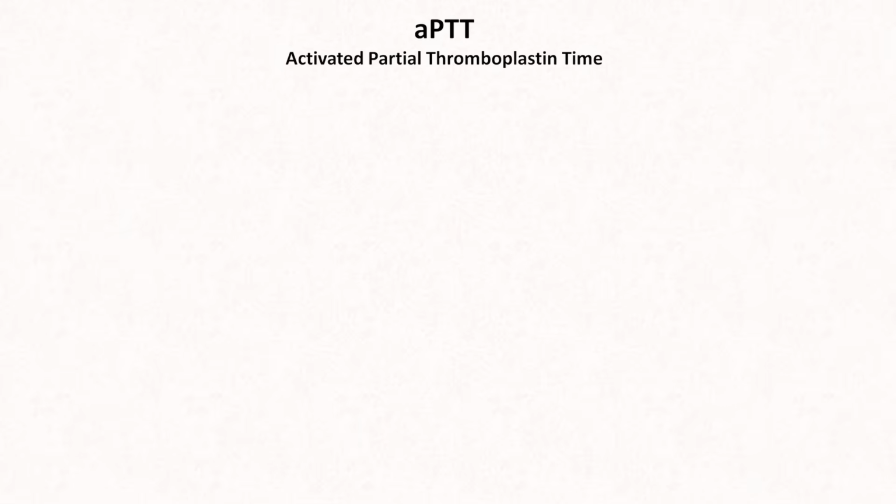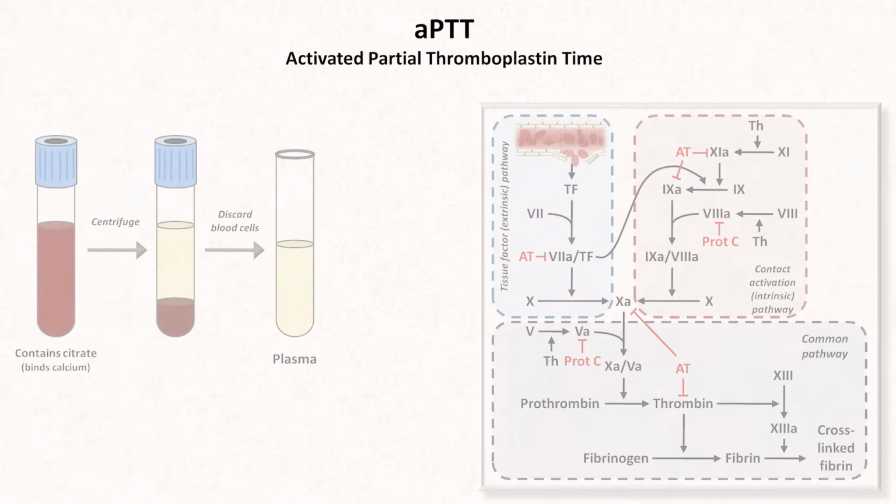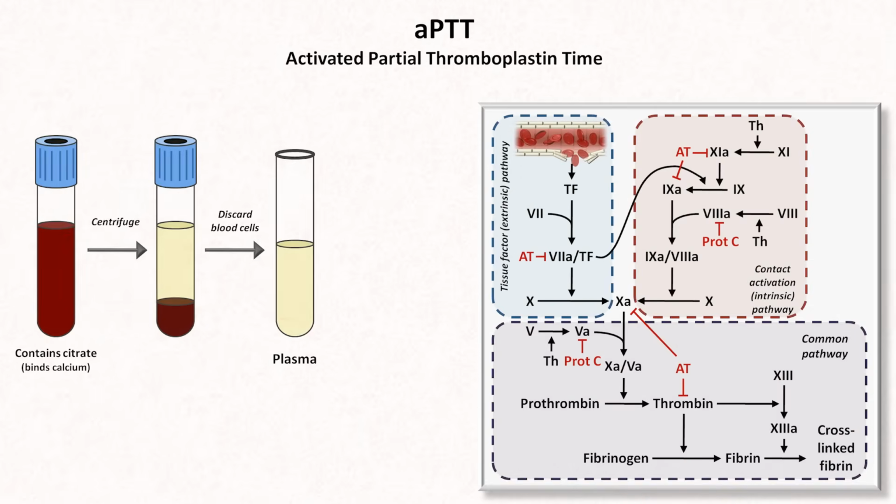The next test to discuss is the activated partial thromboplastin time, frequently called the PTT. I don't actually know why everyone always drops the A when saying it aloud, but they do. This test is nearly identical to the PT, with one important difference.